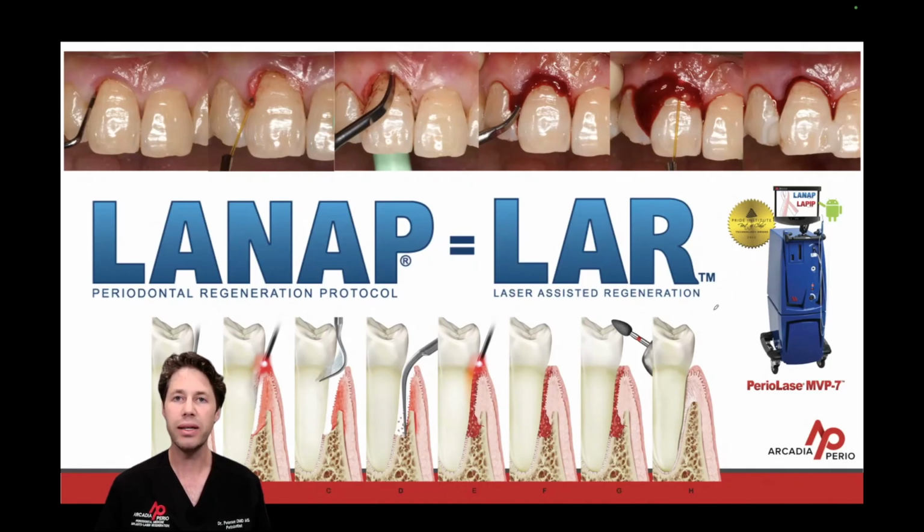Step B is going to be our ablation, or selective removal, of the diseased tissue and removal of the pathogenic bacteria isolated in that periodontal defect. In step C, we're going to use our piezo ultrasonics to remove any subgingival calculus and subgingival plaque. In step D, we're going to do our blunt dissection and bone biomodification.